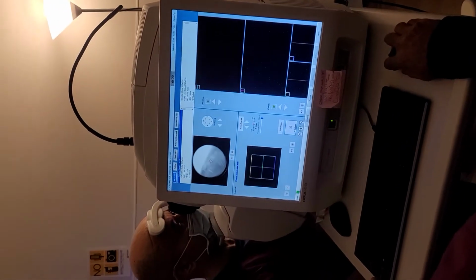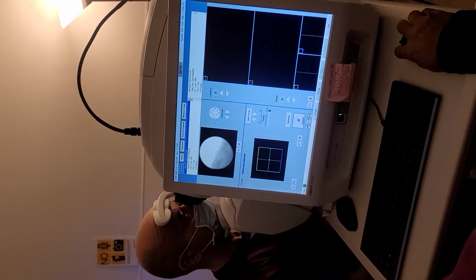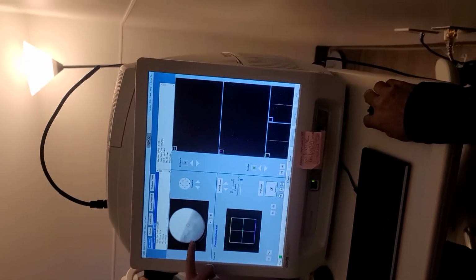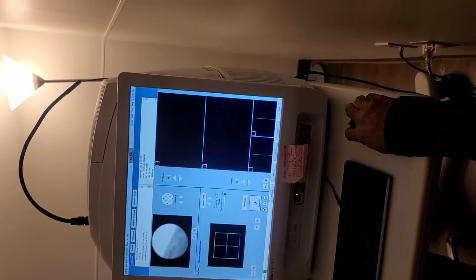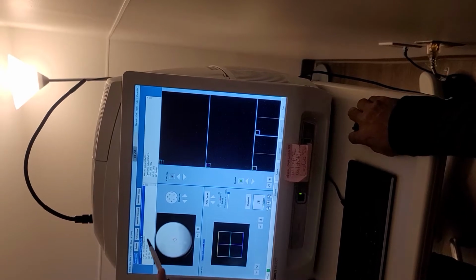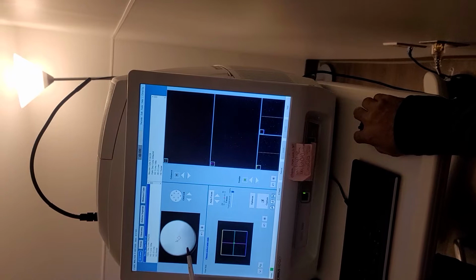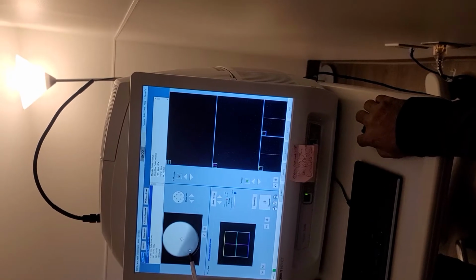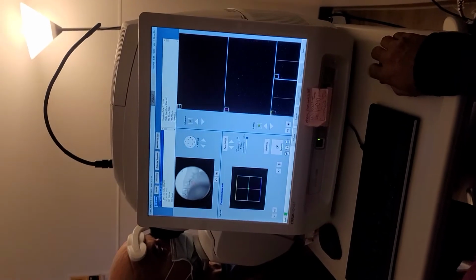Then you have to click this macula first. Yeah, so now you see his eye, he can blink, and now you know that's his eyelid right there. Okay, so just bring... First of all, you have your mouse up here, so your mouse needs to be here. So move your mouse here, and move it over here. See how you bring him over? Okay, don't do that yet.